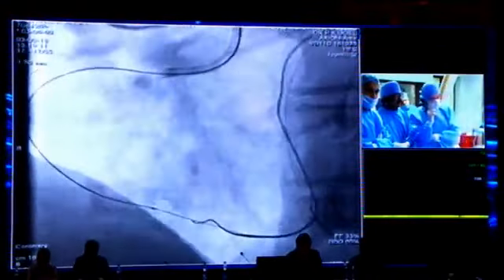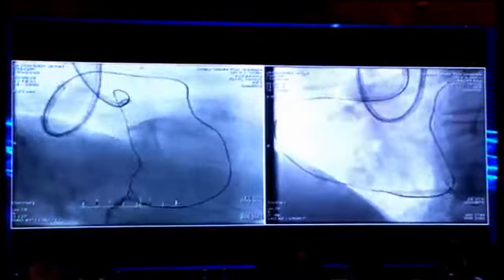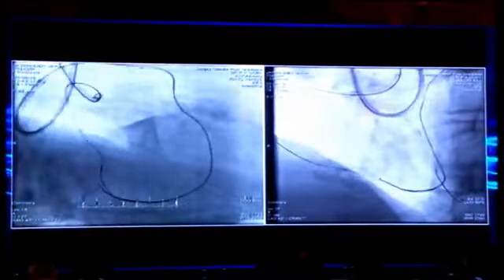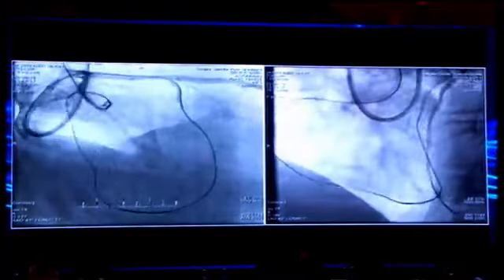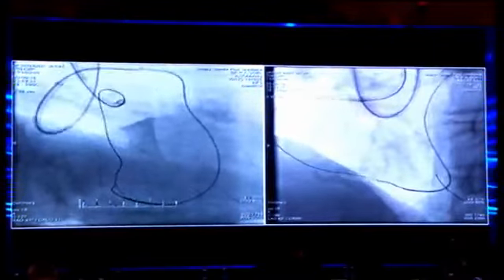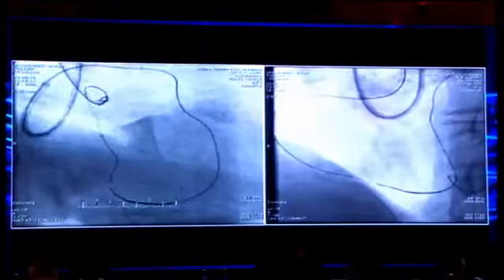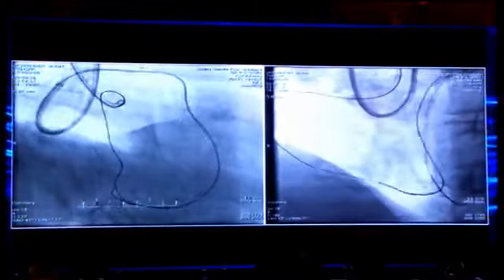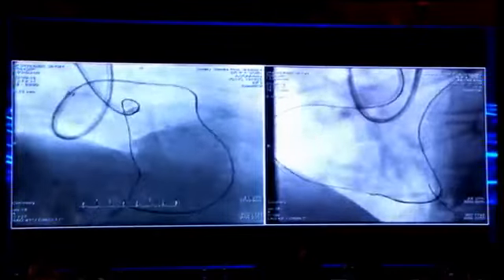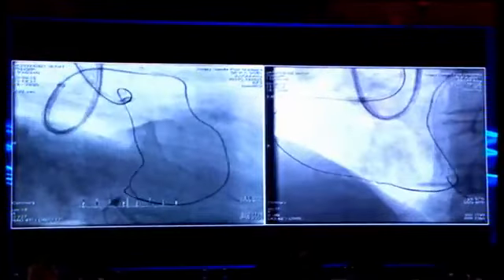Now we did an angio. This is a biplane angio. Here you see the antegrade wire on the A plane clearly going subintimal, while the retrograde wire, which is still the Sion, gives you the right direction. If we had gone antegrade only, we would have created a subintimal plane problem, from the crux of the antegrade.